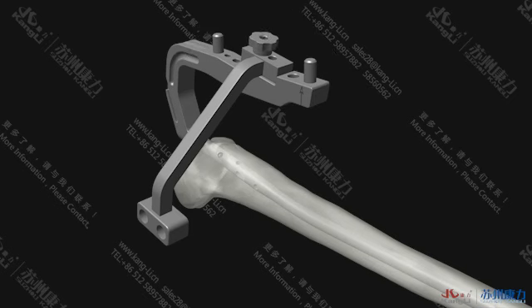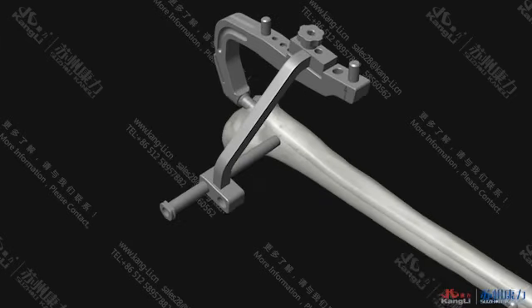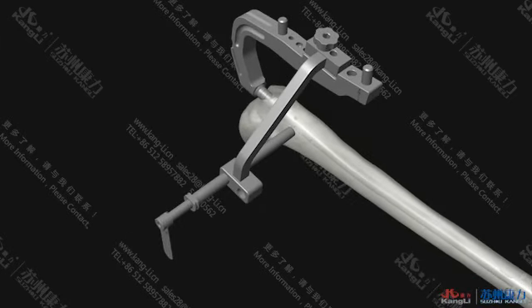Insert the outer sleeve and soft tissue separator into the locking hole of the proximal targeting bracket. Make a 0.5 cm long incision at the place where the soft tissue separator contacts with the soft tissue, and then insert the outer sleeve and soft tissue separator until the bone cortex is reached. Remove the soft tissue separator and insert the phi 4.0 inner sleeve and phi 4.0 drill bit to drill.